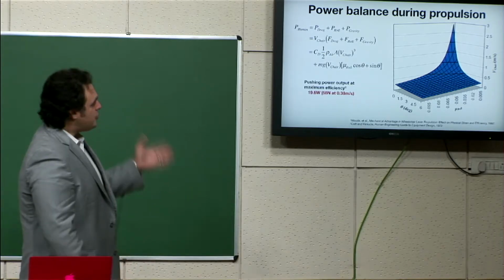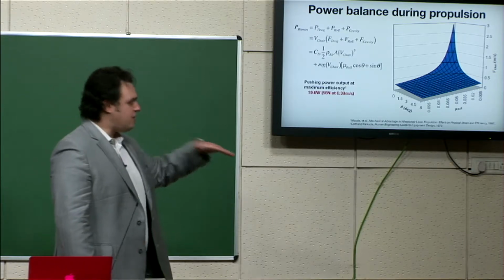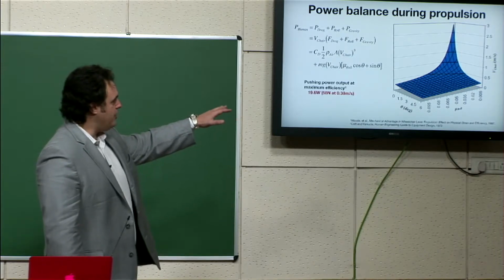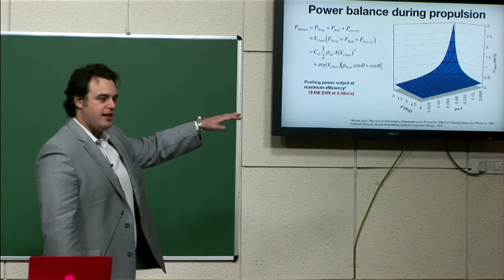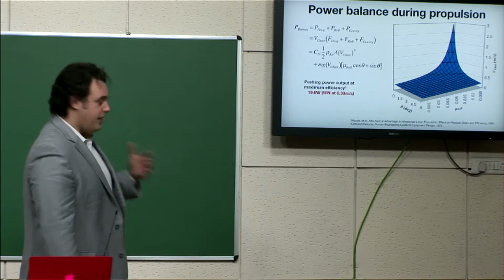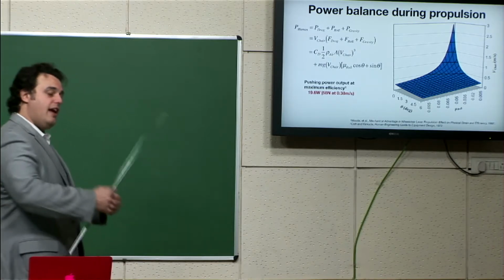And what was cool about this is that we saw that on relatively flat, smooth ground, rolling resistance around 0.01 or so, at 0 degrees climbing, we're hitting a speed of around 2 meters per second. That's 5 miles an hour. That is a fast walking speed. This is a pretty quick vehicle. So this was encouraging to us that, wow, this could actually be a pretty quick vehicle with this limited power source of your arms.